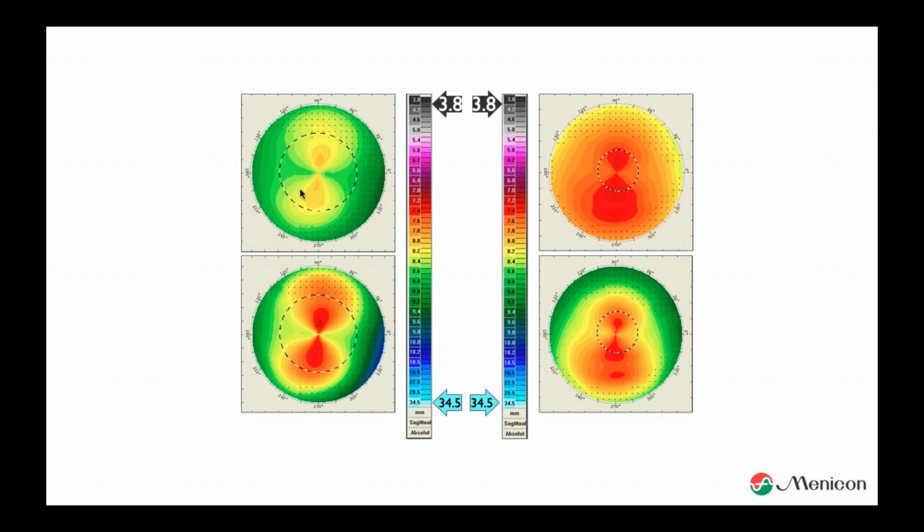Because this one is only useful if you want to compare patients with each other, several persons together. When we are testing lenses, we have different results, and we want to see, okay, what are the steep eyes, what are the flat eyes? But in our practice we are dealing with just one patient in our chair, and you want as much detail as possible in your image, and that's what this map is showing you.